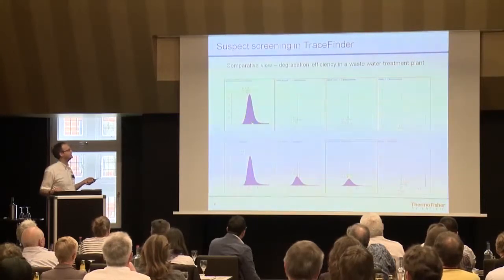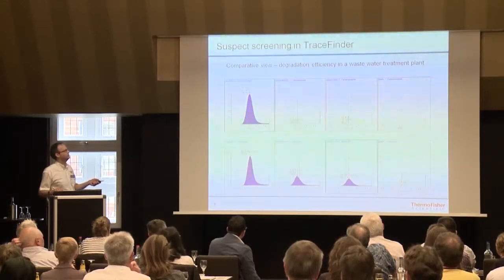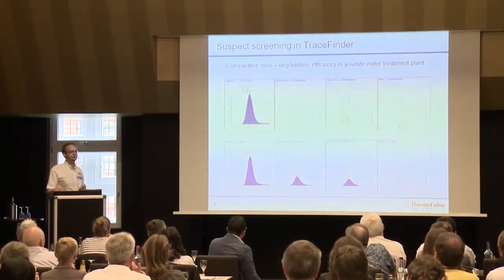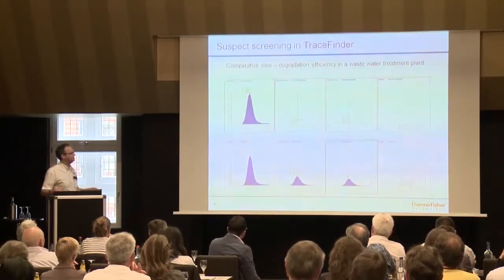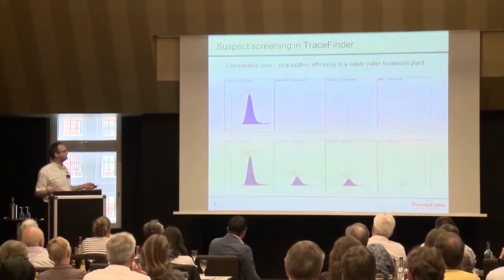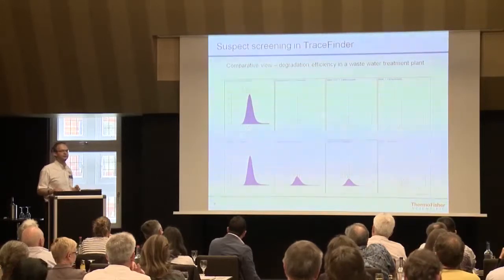a control. And here you can see for carbamazepine, for example, you see it's going in, but literally nothing is coming out. It's really red marked because the ion ratio doesn't fit anymore. It's more or less not detected. But here for another one, metoprolol, for example, you see, okay, the cleanup efficiency is not perfect. It's around 80% because you see this is the 100% peak. And after the second cleanup step, we still have 22% left.